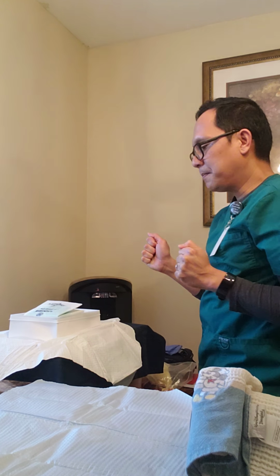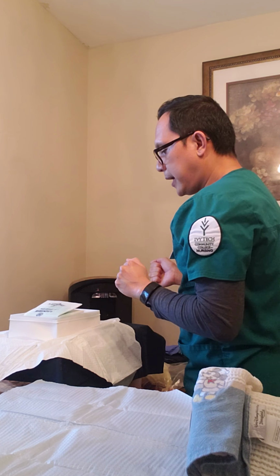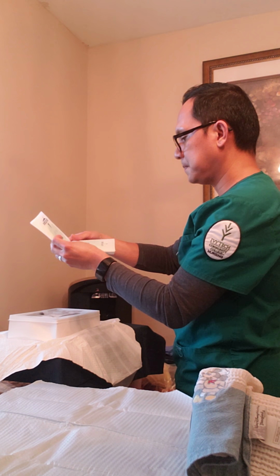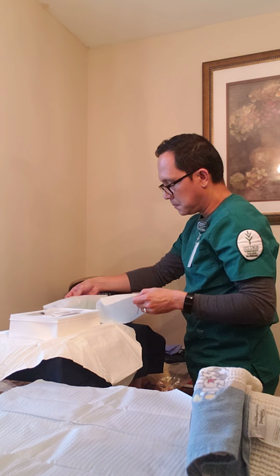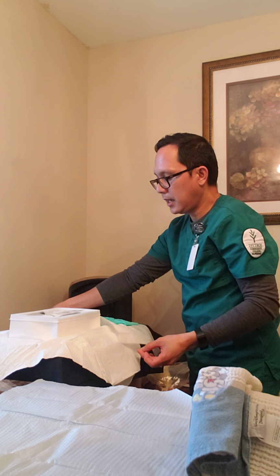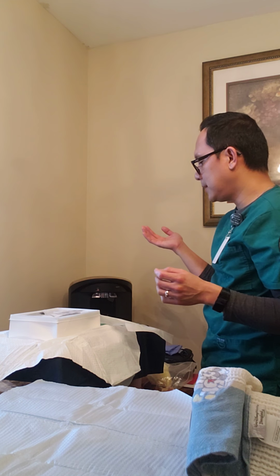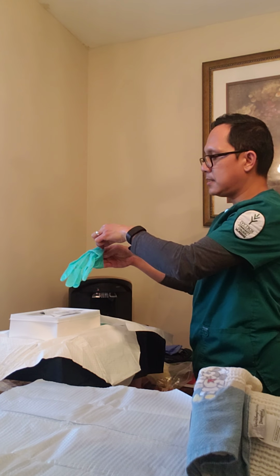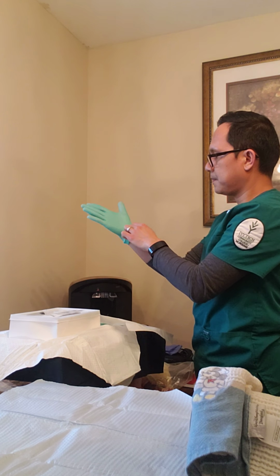Okay, and then once that's done, I'm going to put my sterile gloves on. With my non-dominant hand, I'm going to put the first glove on my dominant hand by holding on to the inside of the glove and putting my hand inside.